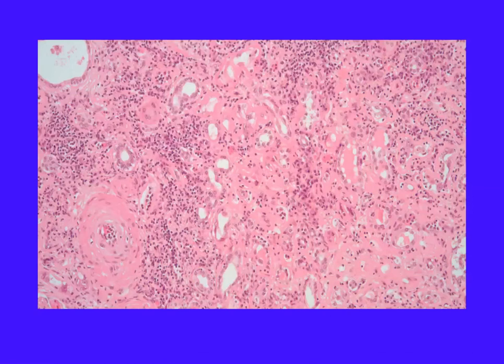In the more severe cases, we have more dense and severe established fibrosis and collections of mononuclear cells in the background interstitium, the tubular atrophy is more widespread, and you can see here that there is an artery in the lower left quadrant of this picture that shows quite marked wall thickening, and its lumen is nearly occluded.